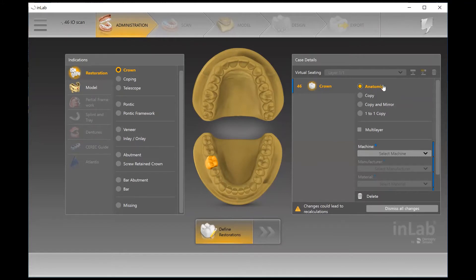Right now I have Anatomic selected, which tells the software that I'm going to design from scratch a new crown for this patient. The next one is Copy, which comes in handy if you have a pre-op scan and you want to copy exactly what the patient had pre-existing.